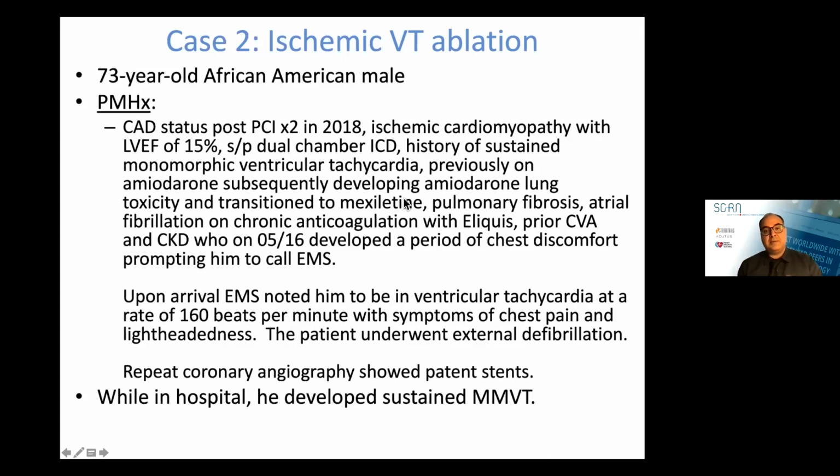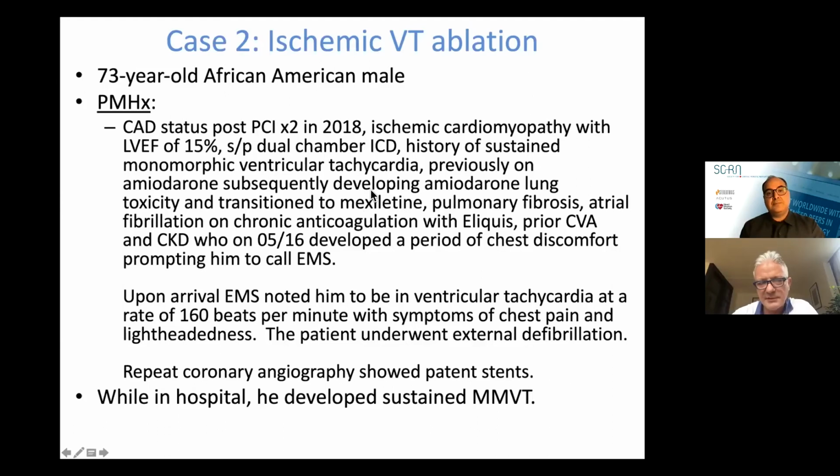There was one question from Pete who joined, but you explained it. I think his question was specifically, he explained very nicely how you go up from a femoral region when it's smooth, but his question was, when it's not going smoothly, what tricks do you have? So usually just rotating the catheter without any deflection will do the trick.